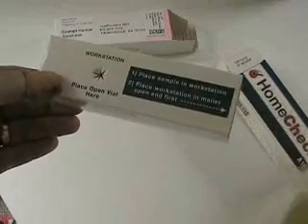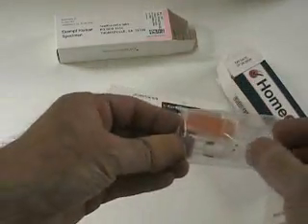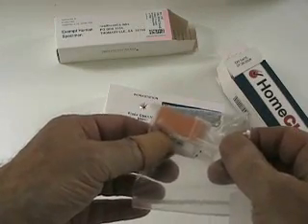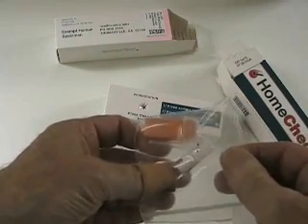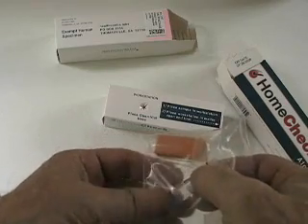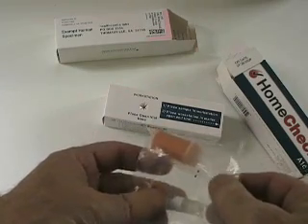You're also going to mail it back inside this. Inside the workstation is a little Ziploc bag containing a lancet for taking the finger stick with, and then a little tube to pull the blood sample up in, and also a little test tube to put the blood sample back into. That's what you mail back inside this Ziploc bag.